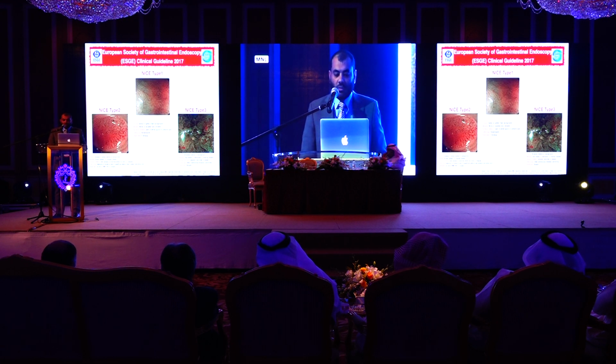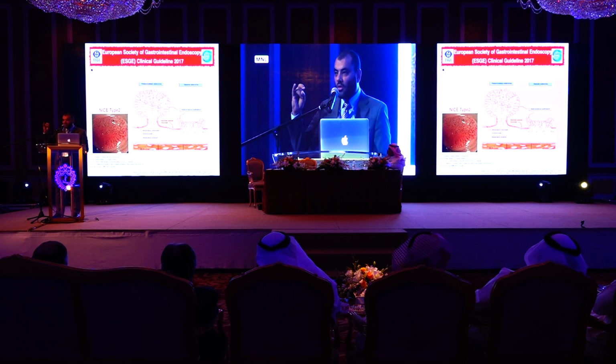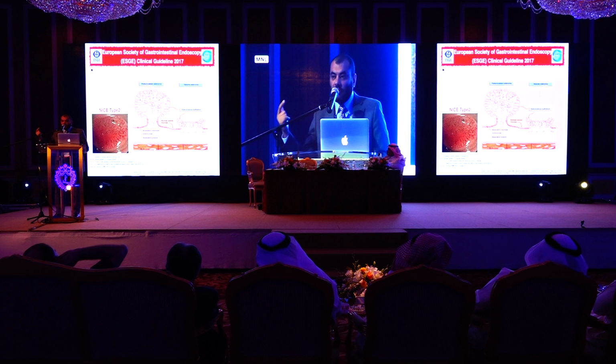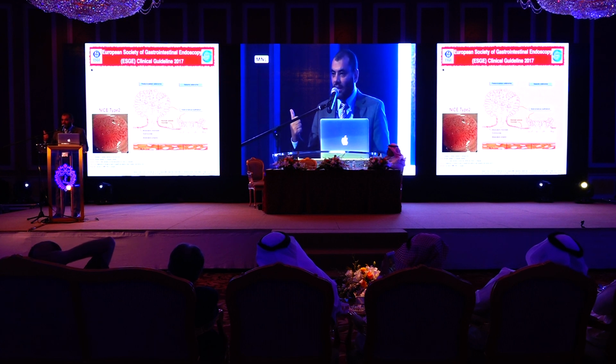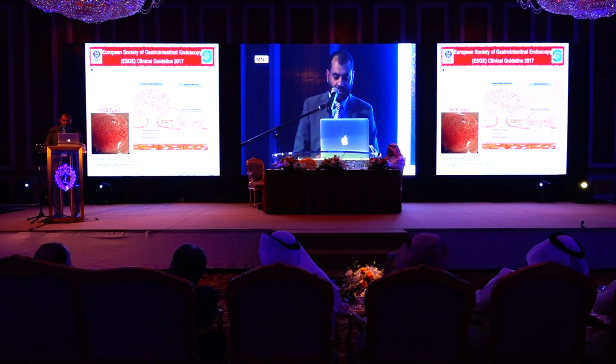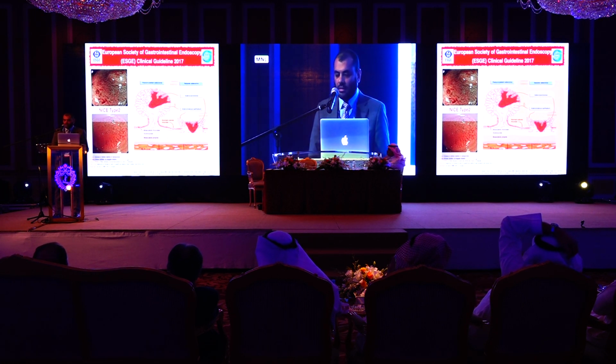Type 1 is consistent with hyperplastic or inflammatory polyps. And type 2 could be adenoma, and this is very, very important. It could be adenoma, intramucosal carcinoma, or even carcinoma, but with superficial submucosal invasion. As we mentioned before, that is less than 1,000 microns in pedunculated... less than 3,000 microns in pedunculated and less than 1,000 microns in sessile. So if we examine a simple adenoma without any cancerous tissue or high-grade dysplasia, we'll find this: the vessels are short and thick, the surface pattern is tubular, and the whole color is brown.